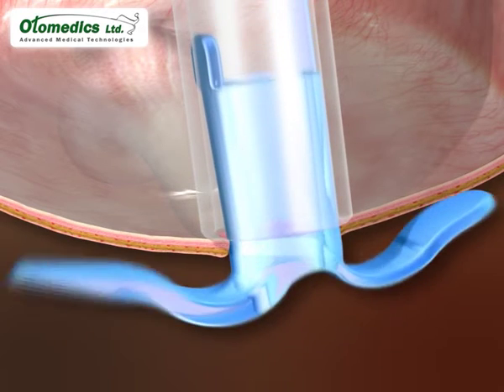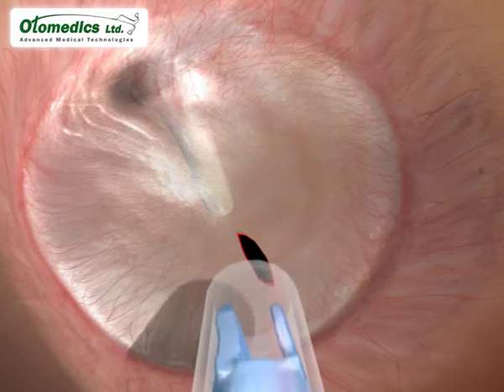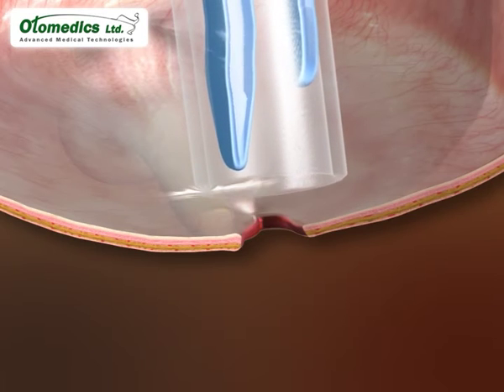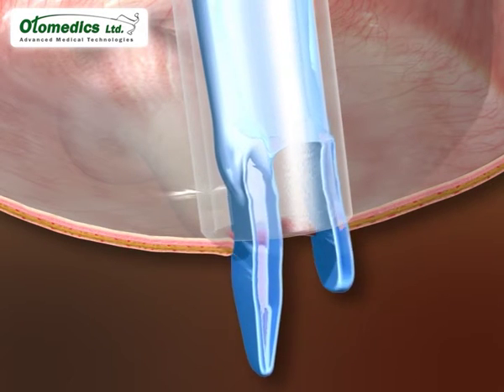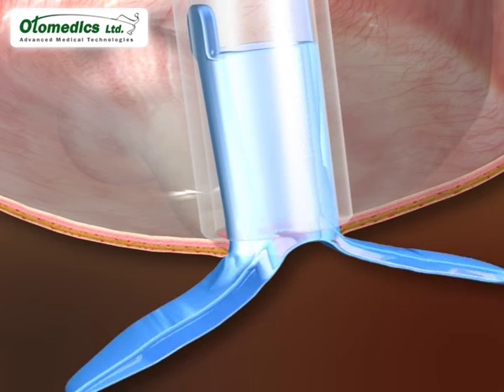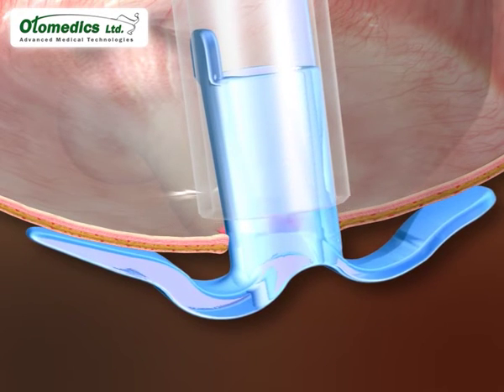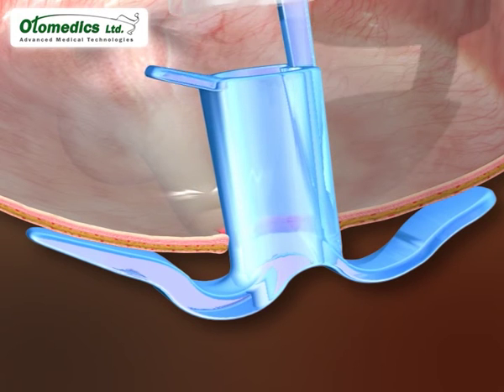It is easy to insert using the quick inserter. The tube is easily inserted by pushing the inserter's lever while the long arm automatically points anteriorly. The short arm is then pushed inside the tympanic cavity in the same movement, keeping the extraction arm in a posterior position.